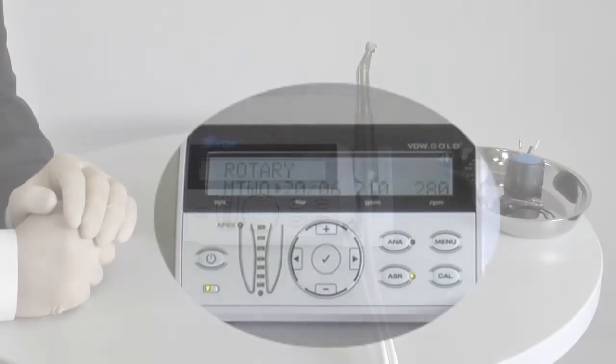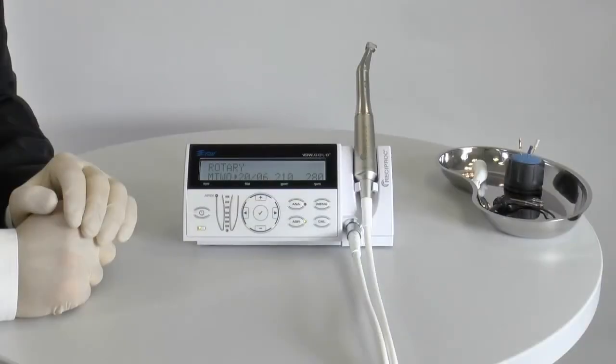Change the file sizes with the plus and minus keys. The VDW Gold Reciproc is a torque-controlled motor and has two safety features for rotary file systems.